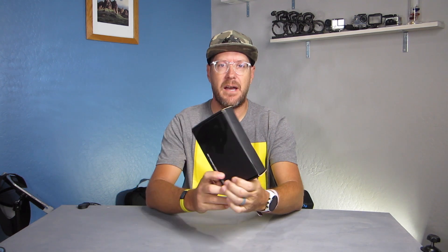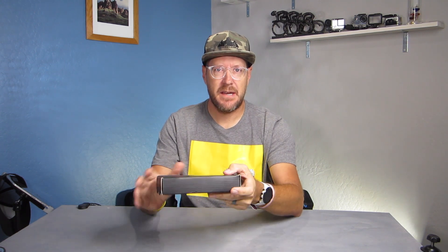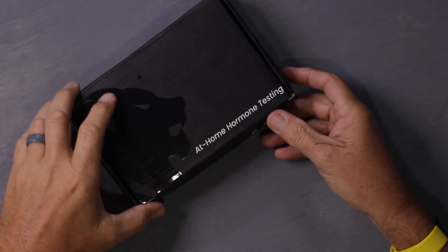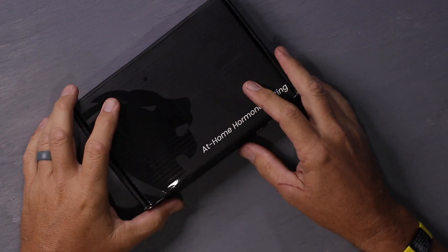I have the Peak at-home hormone testing kit and I'm going to show you exactly how to use it, following the step-by-step instructions inside. To begin with, I have fasted for the last 12 hours — that's something you're going to need to do — and you want to collect the blood sample before 10 a.m.